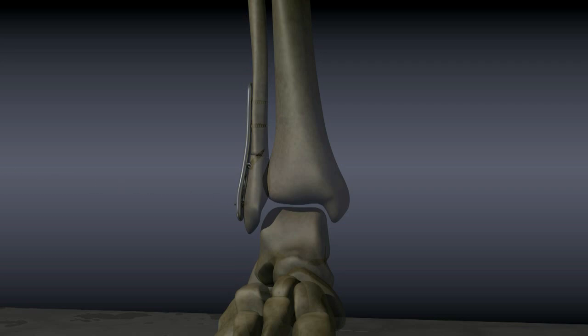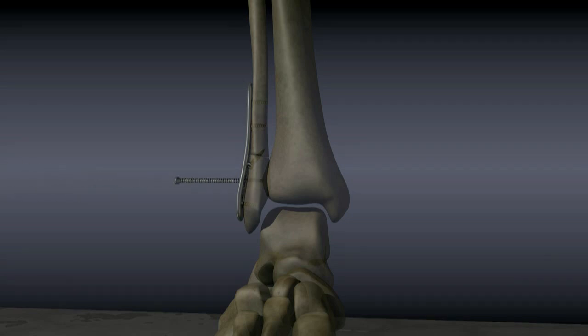The syndesmosis, as was previously mentioned, is a complex of ligaments that hold the fibula and tibia together. If the syndesmosis has been disrupted and is unstable, a large syndesmotic screw may be used to fix the fibula to the tibia.